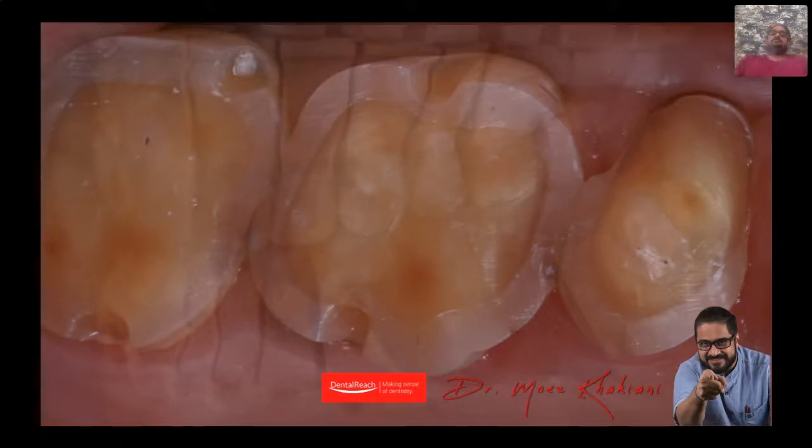Here, what am I doing? I am simply replacing the occlusal enamel anatomy. If you're wondering why I have grooves there, a buccal groove, a palatal groove, it is not for secondary retention or resistance. It is for orientation. Remember, when I do only a flat occlusal prep, I don't know where the tabletop or the overlay sits. If I end up mispositioning this even by 1 degree, be rest for sure, once I bond the 6 in, the 7 will not go in. Which is the reason why I make these grooves, so that I have orientation in seating.